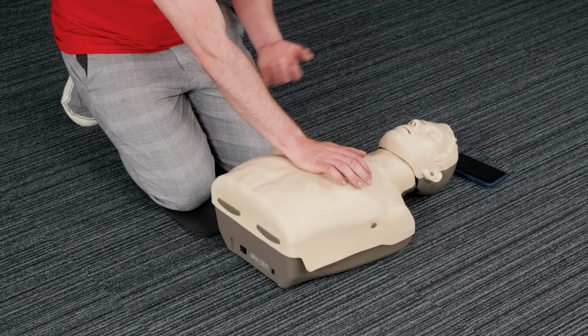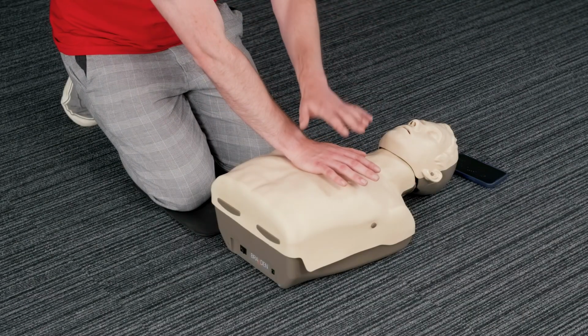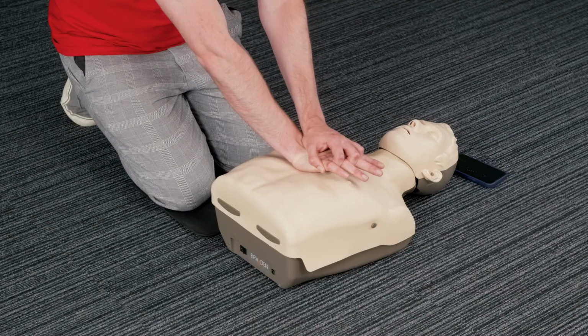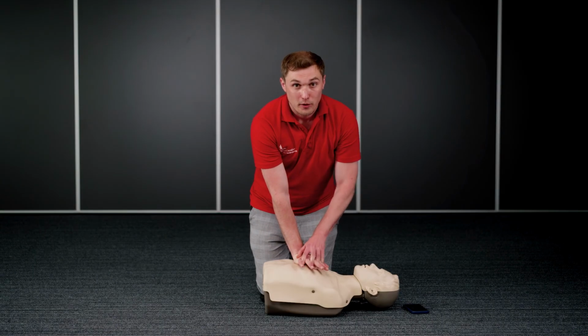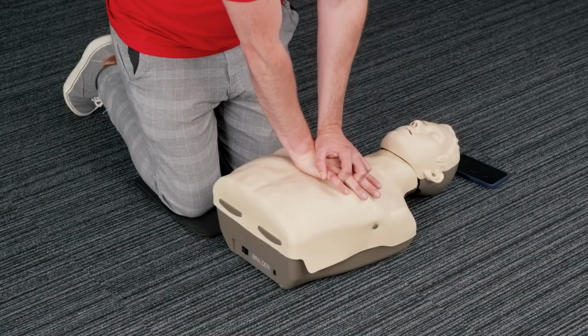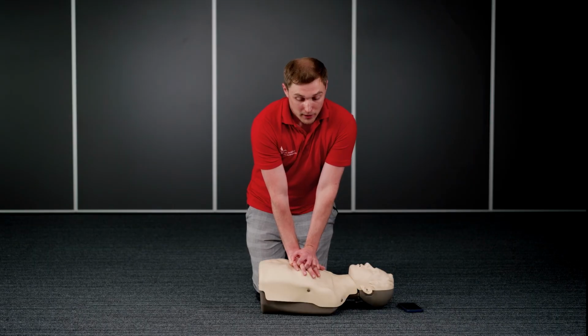I'm going to take my second hand, place that on top of my first and interlock my fingers, pulling my fingers back slightly. I'm then going to kneel up straight so that my wrist, elbow and shoulder are all in line with each other and my body is over the casualty. I will then start downward compressions.